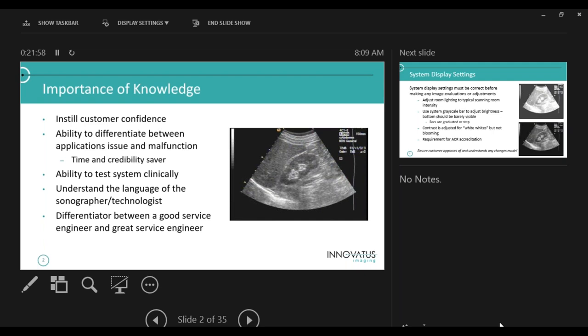The ability to test the system clinically is important. I used to carry around a tissue-mimicking phantom as a service engineer, but I was my own phantom — I didn't really bring my phantom anywhere. Anytime anybody had an image issue I just scanned myself. By the way, all the images you'll see throughout here, except for the fetal images and a couple with pathology, are on me. As I wrote this class I just got in front of the machine and started doing screen grabs — so this over here is me.